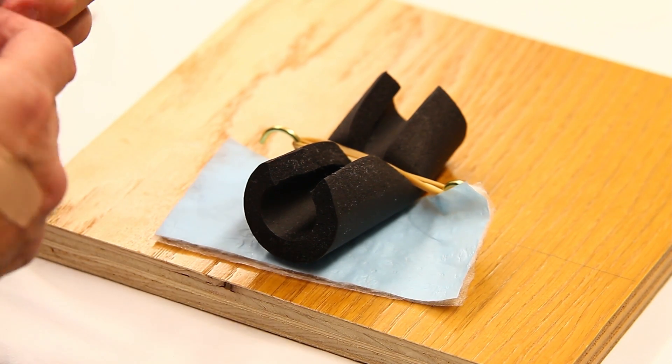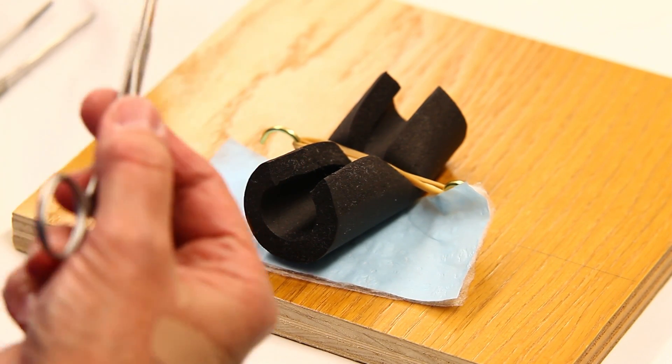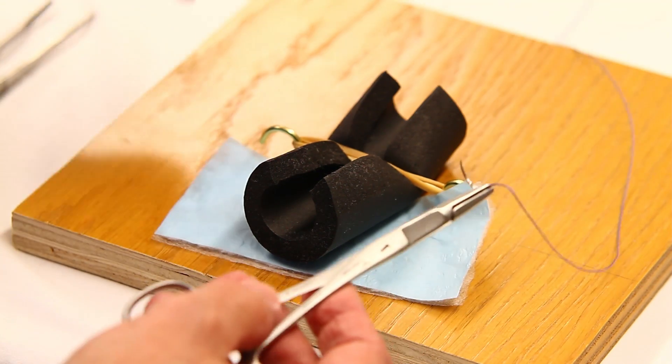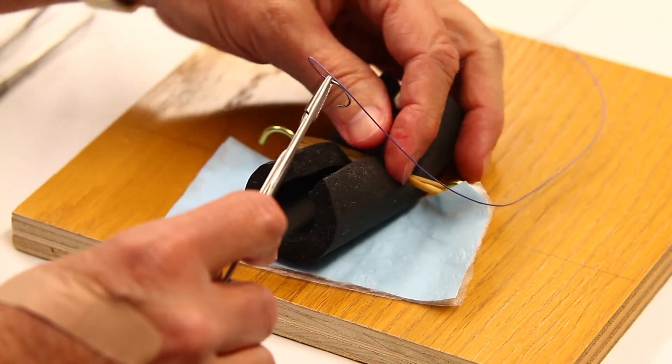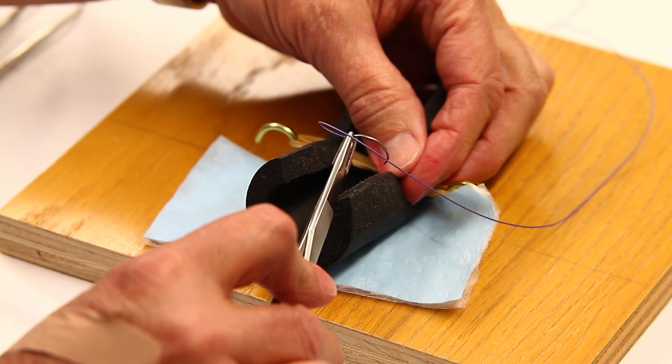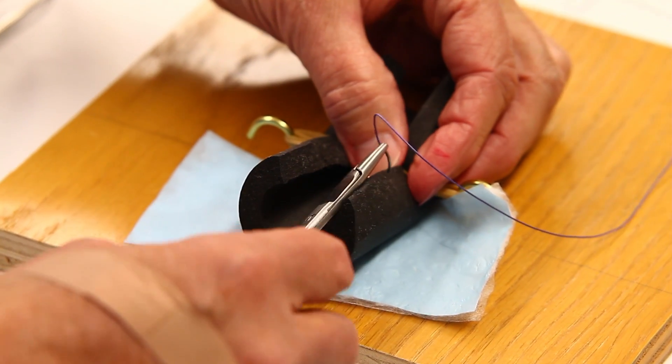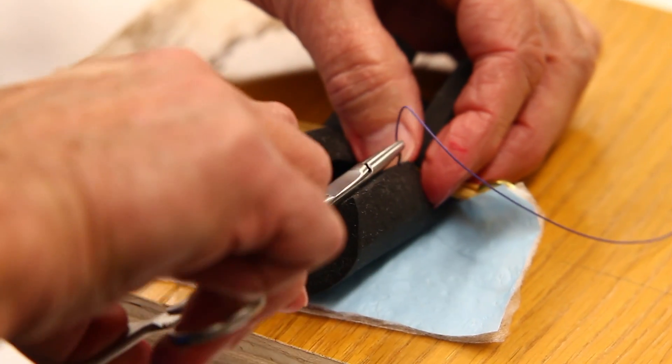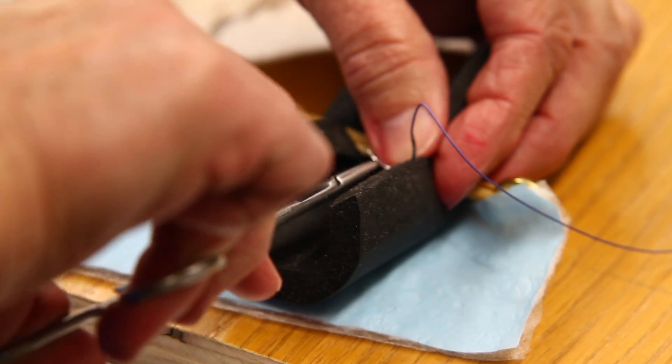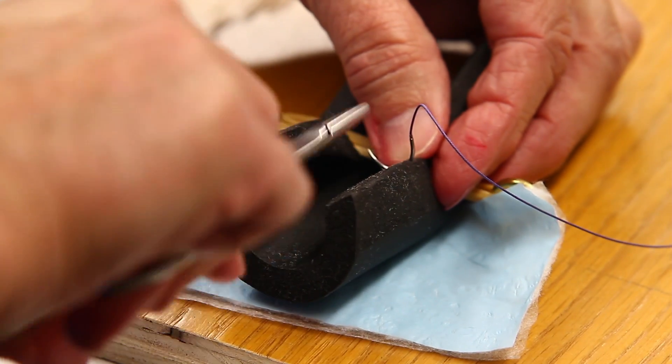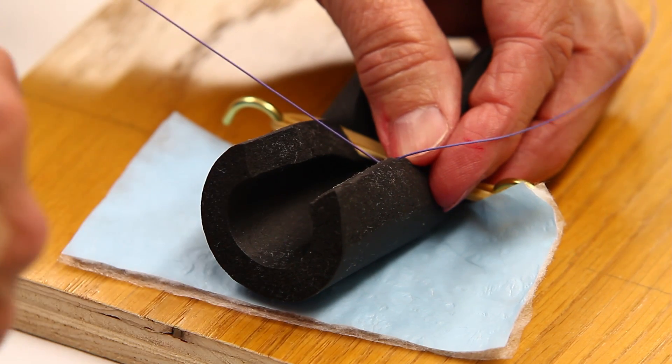The suture we're going to use is CT2, and it would be 3-0 or 4-0 Vicryl. You enter the spongy tissue with a very delicate touch, release the needle, grab it, and follow through with the arc of the needle so that you don't tear it through.